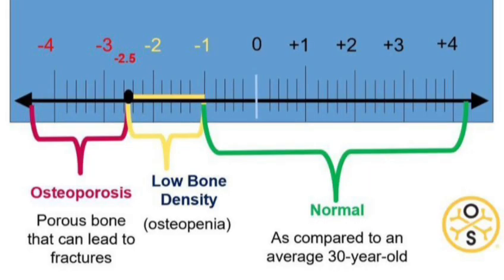By seeing the T-score, we can tell if the patient is normal or is having osteopenia or osteoporosis. If the value lies between 0 to -1, it is normal. If the value lies between -1 to -2.5, then it is osteopenia, or below -2.5, then it is osteoporosis.